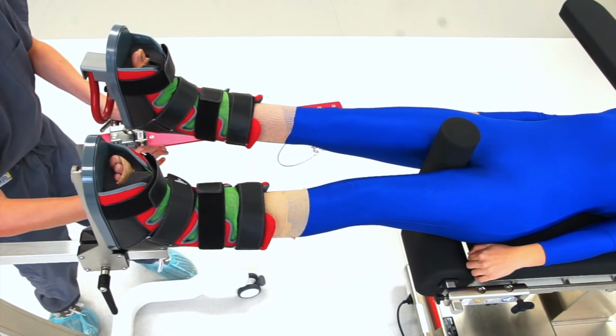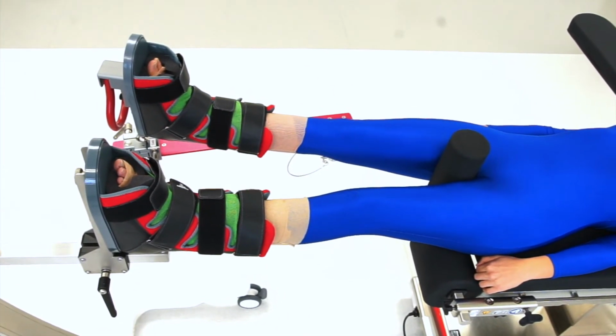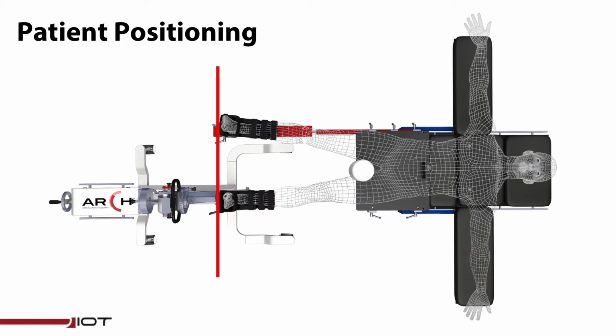Pull back on the arch to further ensure the patient is tight against the post and the pelvis is straight and not tilted in either direction. Ensure the bottom of both traction boots are aligned. This is a good indicator that the pelvis is straight.